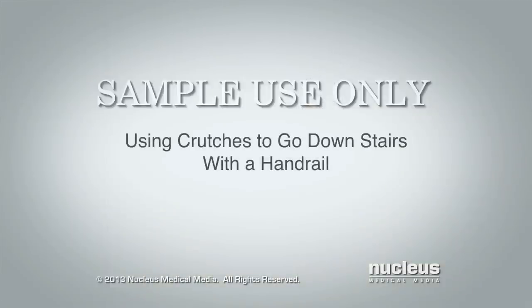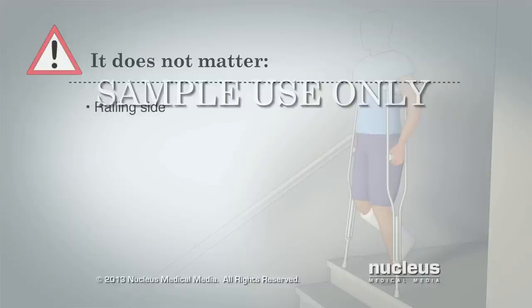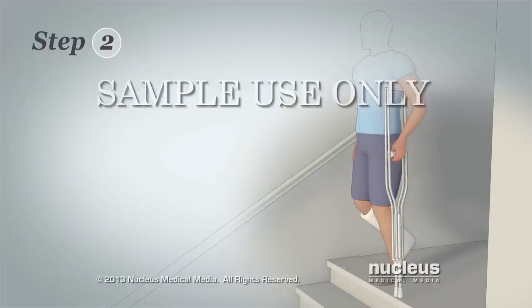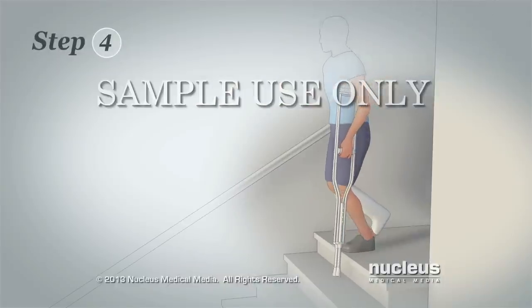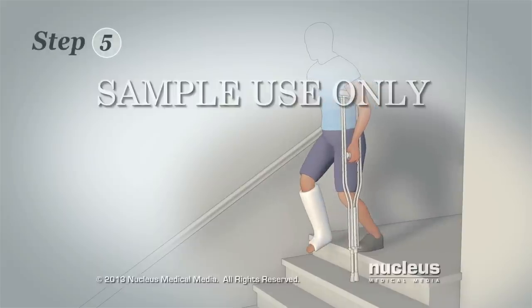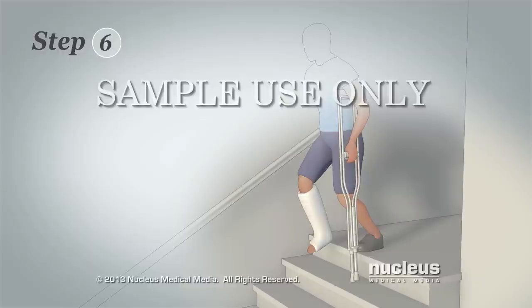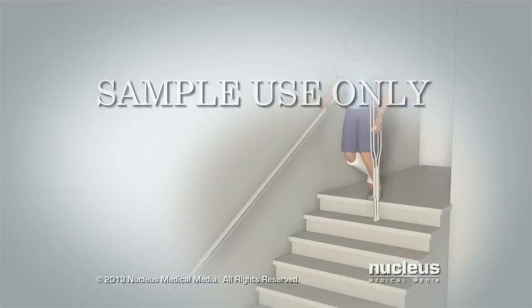Here's how to go downstairs with a handrail. Step 1: Begin as close to the stairs as possible. It does not matter which side the railing is on or which leg is injured. Step 2: Move the crutch nearest the railing to the opposite arm and hold both crutches by the hand grips with that hand. Step 3: Grab the railing with your free arm. Step 4: Place your crutches together onto the step below, making sure to place them in the middle of the stair to help balance your weight. Step 5: Move your injured leg forward slightly and lean your weight on the railing and the hand grips of your crutches. Step 6: Using your uninjured leg, step down onto the next stair step. Repeat this process for each stair step.